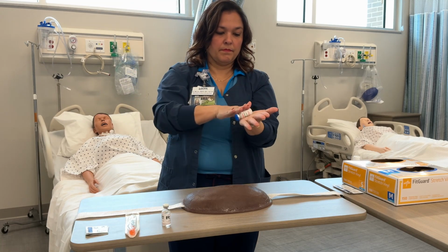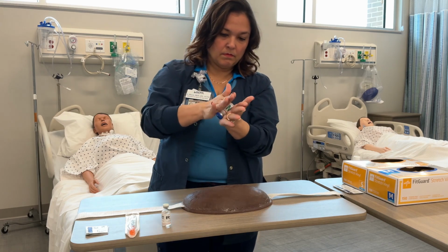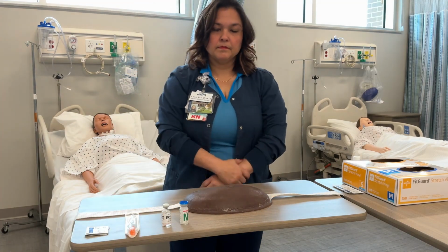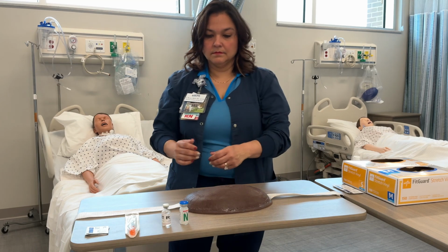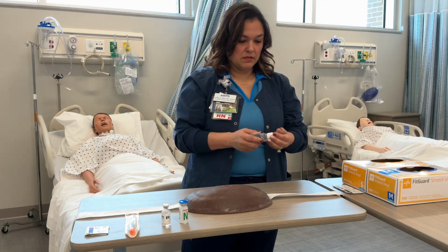All right, so we have also gathered our supplies, so you're going to need both of your insulins. You need an insulin syringe, and you need some alcohol. Once we've done that, we're going to make sure we pop the tops on both of our insulins and clean them. I'm going to clean my hands first.